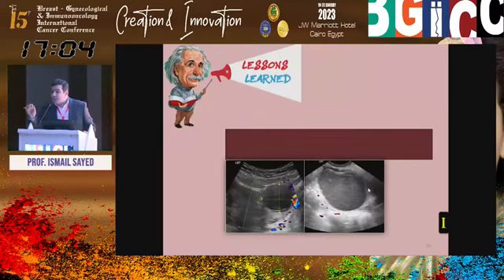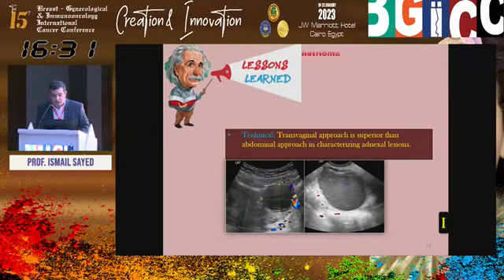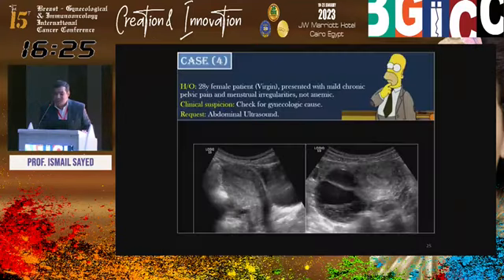So if classic endometrioma, this is usual case. If kissing endometriosis or fixed endometrioma, endometrioma in fixed posterior position to the uterus or inferior position, complement by transvaginal dynamic. Sliding of the uterus, sliding of the ovary, look for bowel and urinary bladder endometriosis. If not by yourself, it's okay. Ask for a consultant. So this case needs to be referred to a higher level. Basically, transvaginal is superior to abdominal, and if you see this pattern of endometriosis, complement.